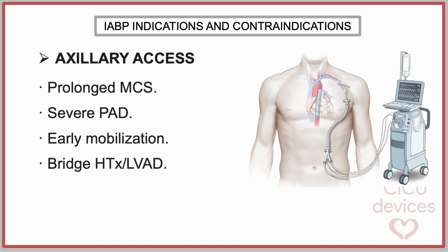From a hemodynamic standpoint, the performance of the IABP via axillary insertion is equivalent to that of the femoral route, providing the same diastolic augmentation and afterload reduction.